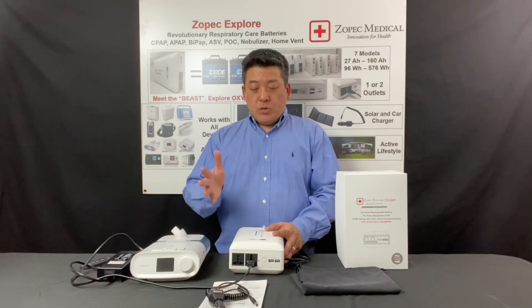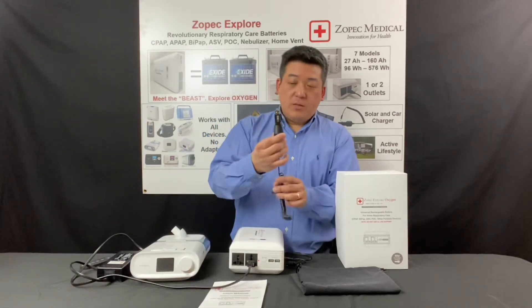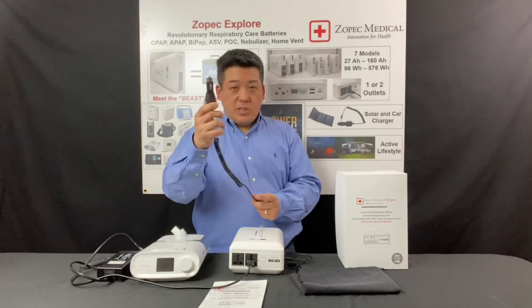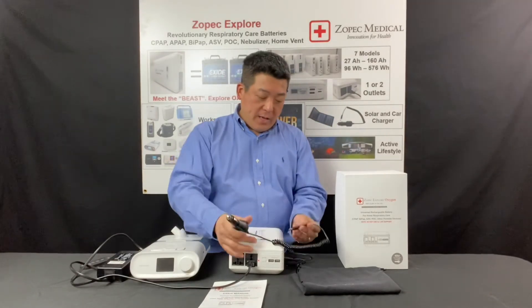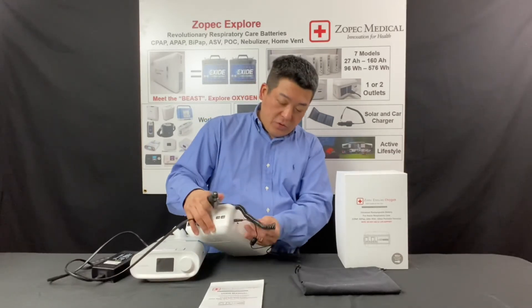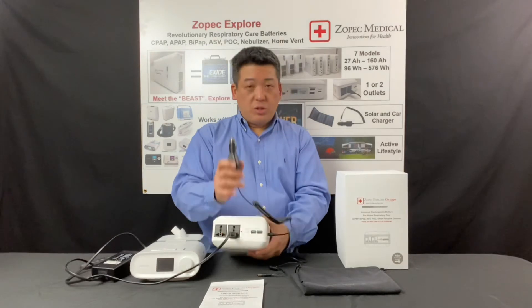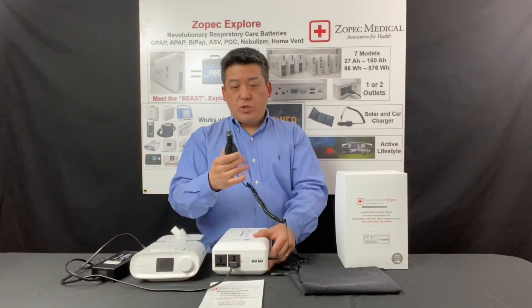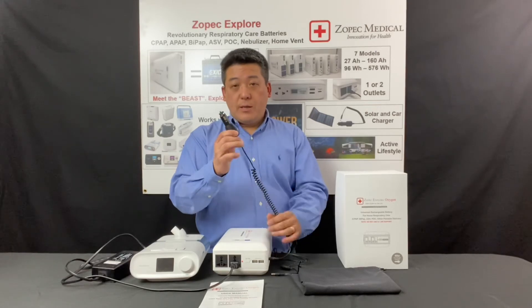To charge with your car, plug the fast car charger into your 12-volt cigarette lighter in your car or RV, then use the same charging port on the battery. This is a 45-watt fast car charger, which is almost as fast as charging at home.